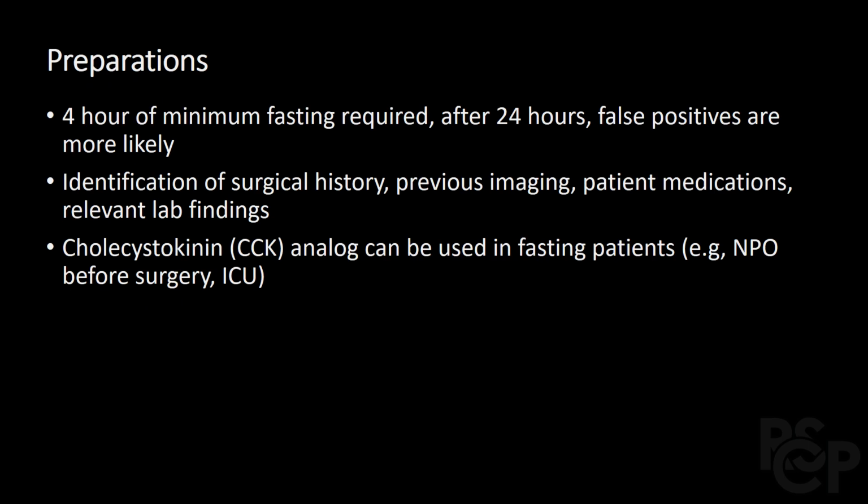So in order to prepare for the HIDA scan, a minimum of 4 hours of fasting is required by the patient, and after 24 hours, false positives are more likely. This is because after 24 hours, the gallbladder becomes over-distended with bile, so that can lead to false positive results. In certain cases, CCK analogs can be used in patients who've been fasting for long periods of time. For example, if the patient is NPO before a surgery or an ICU patient, you can use CCK analogs to stimulate the gallbladder.